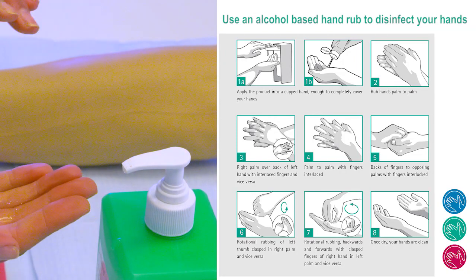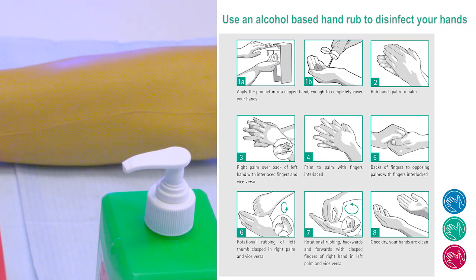Alcohol gel your hands. You are now ready to carry out the cannulation procedure as demonstrated in this video.